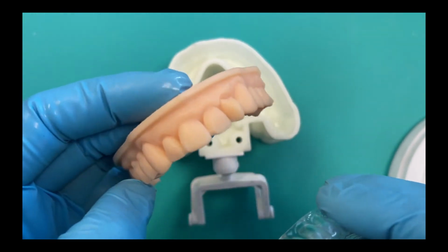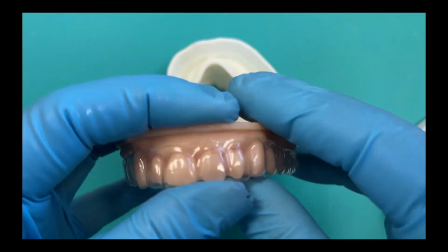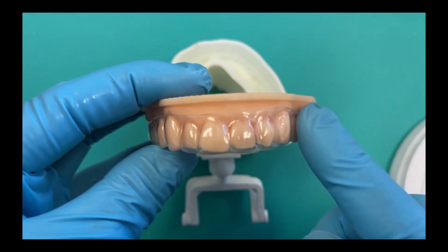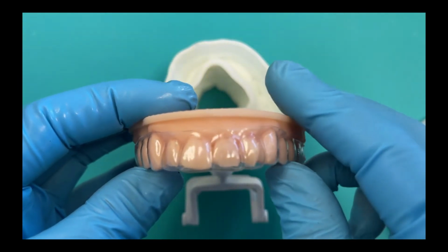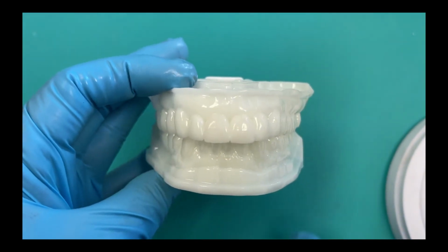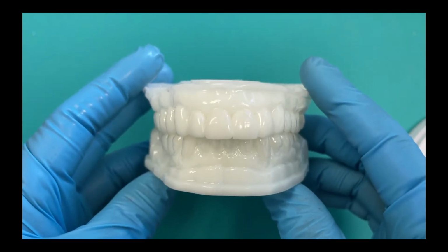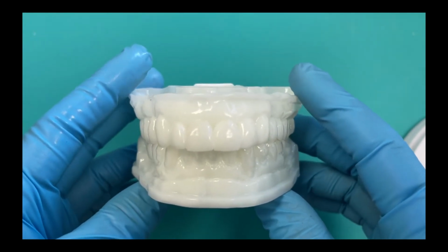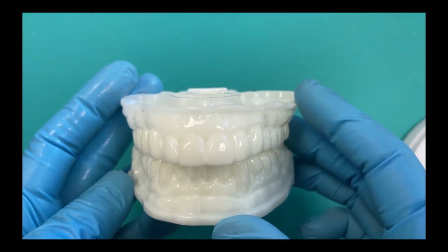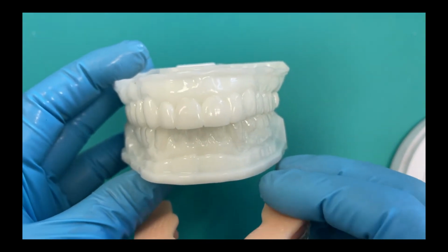And by filling this with a bisacryl material like Luxatemp, you can then put it onto the patient's teeth. Of course, it's not 100% accurate because we haven't done any preparation, but you can see as it snaps on here to the model that we have space to be able to show the patient what it's going to look like. Because we want to do some of the teeth non-prep, no prep, we can end up with something that can be a little bulky. But if you're doing 7 through 10 and you've got good presence of the cuspids there, it's going to look really nice, as you can see it does on the DWAX here.